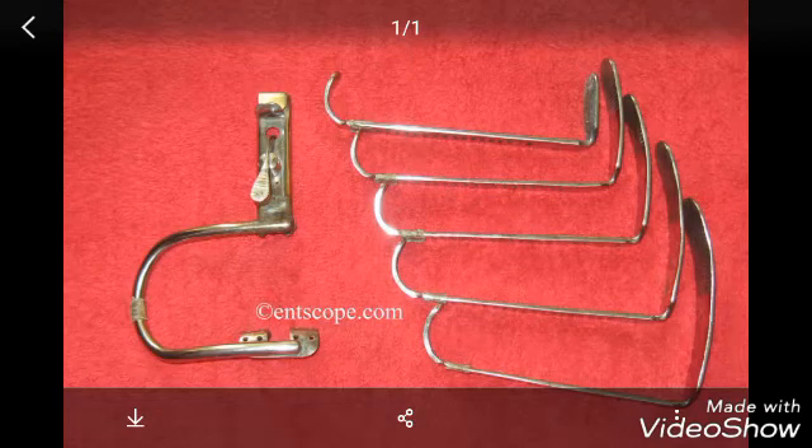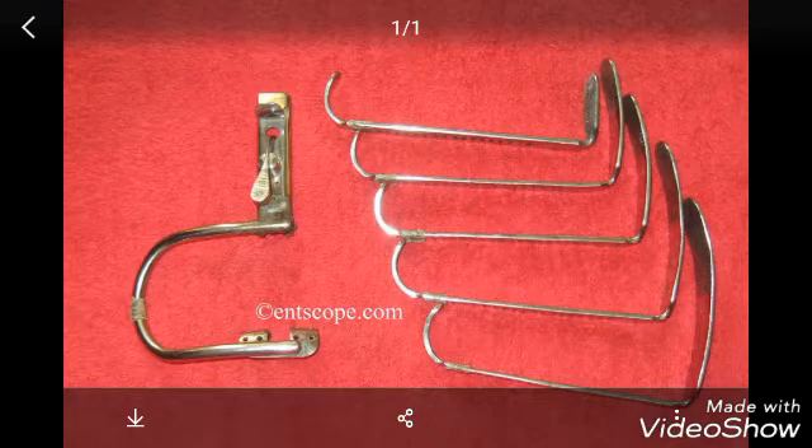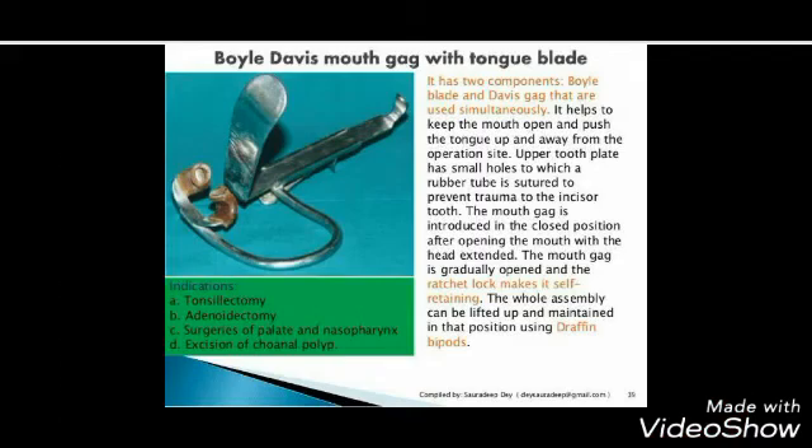It is the Boyle Davis Mouth Gag, used for opening the mouth and retracting the tongue anteriorly in various operations, including tonsillectomy, adenoidectomy, surgery of the palate and nasopharynx, and excision of choanal polyp.